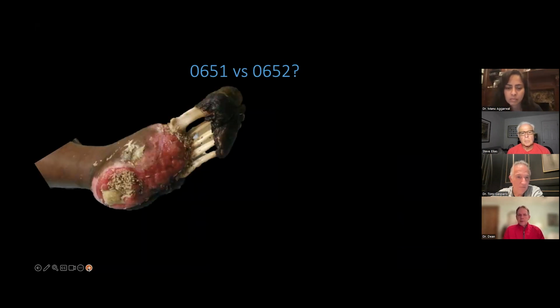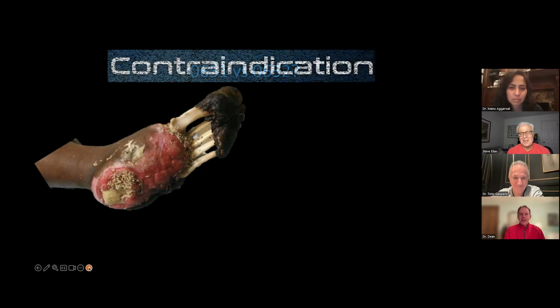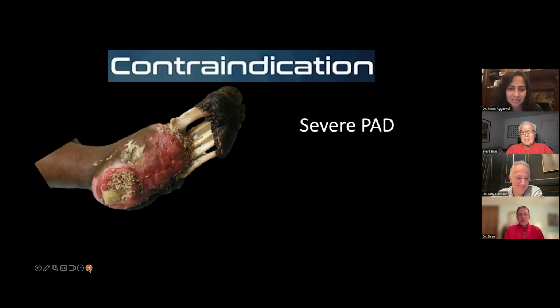651 or 652. Well, another contraindication. Absolutely. In fact, we have two contraindications here. Number one, severe PAD with critical ischemia and gangrene, and actually a skeletonized foot. Probably not the best to utilize a pump in this situation.